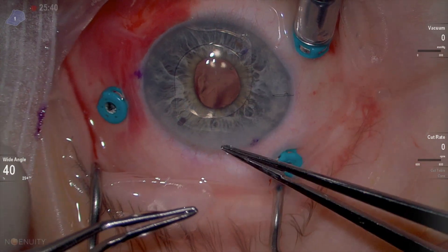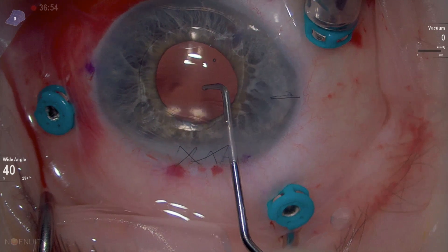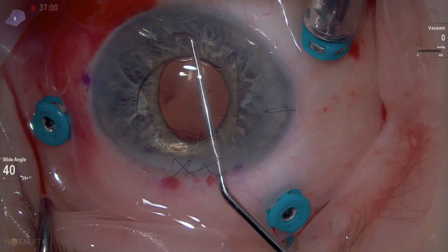Always pick up the wound and have a look. Here we close with a running suture. After the iris is slightly peaked, the way to free the iris is to hold onto the haptic, pull it in and up towards the cornea, and that will free any entrapped iris.